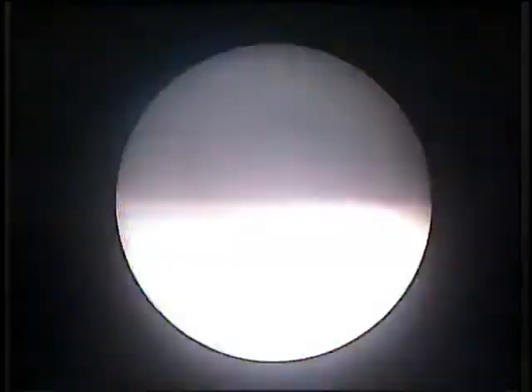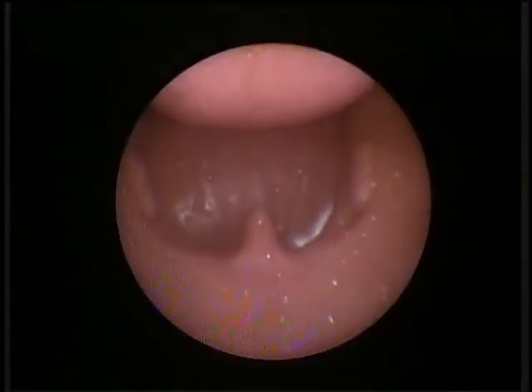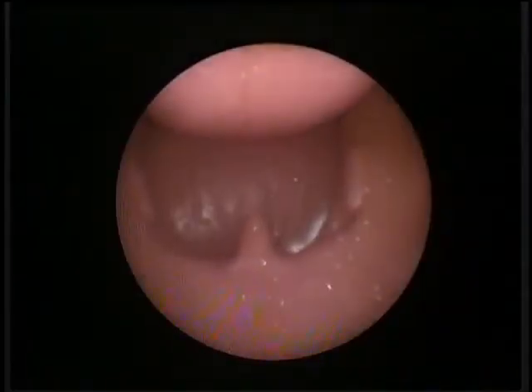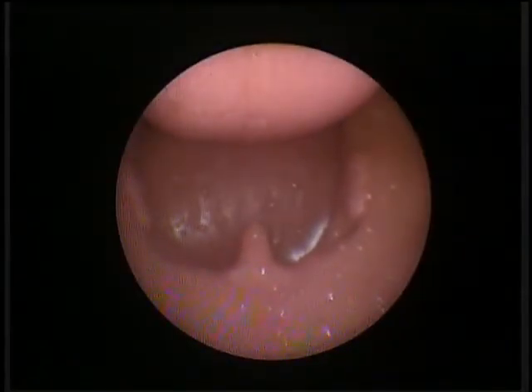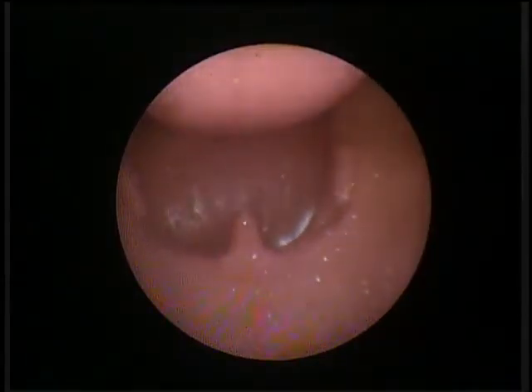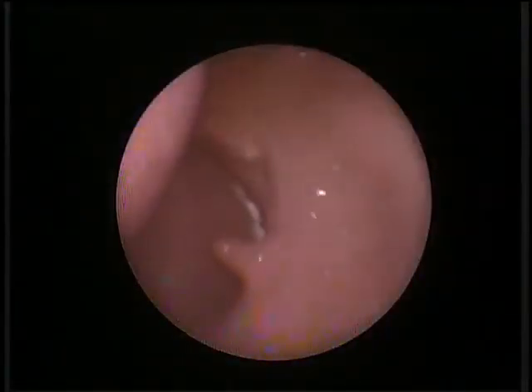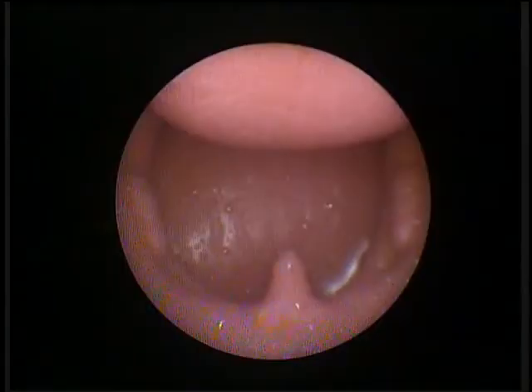Our next goal is to open the mouth, using a cross-finger technique. We know we've done it when we've opened the mouth enough that the mandibles have translated. Our next goal is blade insertion — insert the blade one inch into the mouth, just like that. Only one inch of the laryngoscope is in the mouth right now. If you can't get it in because the patient's chest wall is blocking you, go in horizontally one inch and turn.